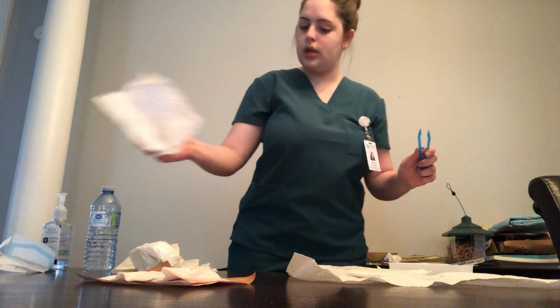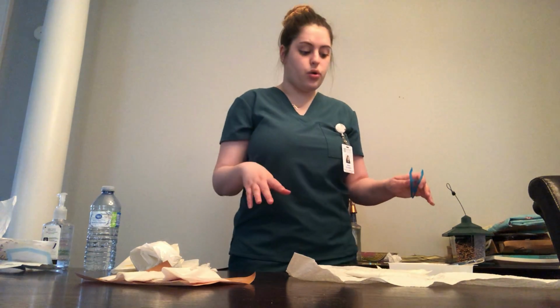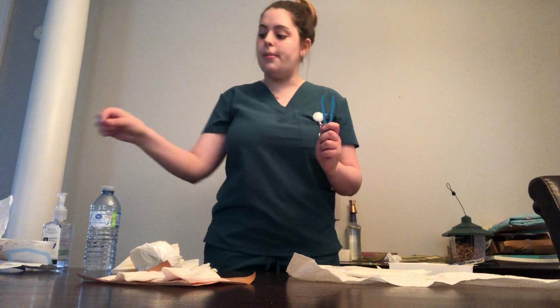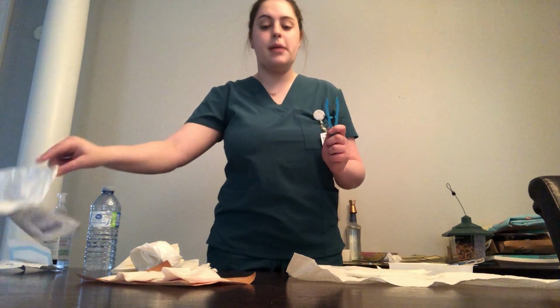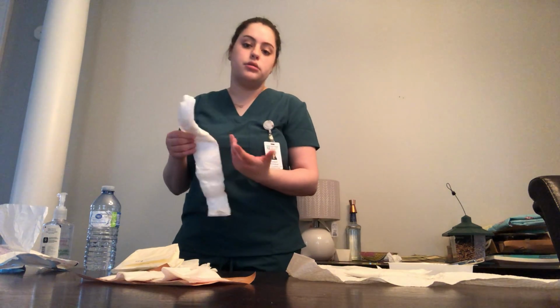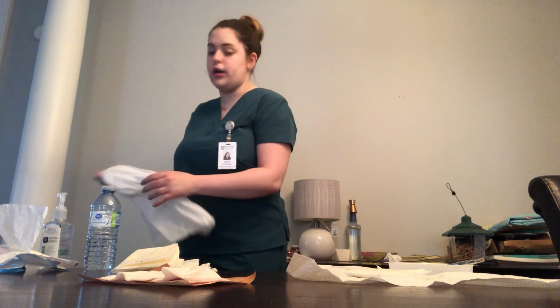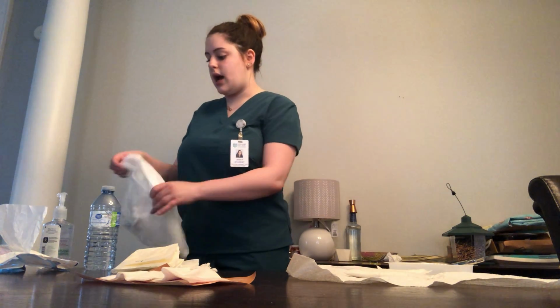Okay, so once you've done that, your tray is set up. I have my gauze on there, my forceps where I want them to be, and my abdominal pad. These have come in contact with your paper, so they are considered contaminated. Those will go in the garbage. You won't use them again. I have my garbage here. It is considered dirty, so I don't need to worry about keeping it sterile. I'm going to set it up, put it on the end of my bed, and then wash my hands.